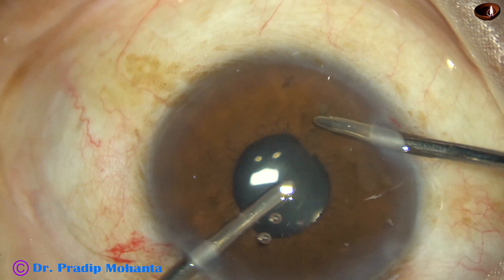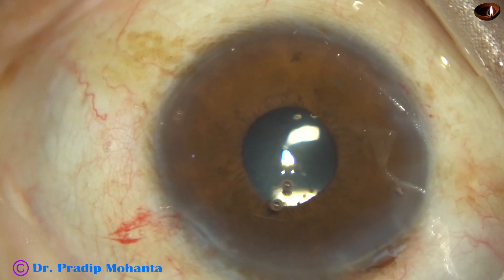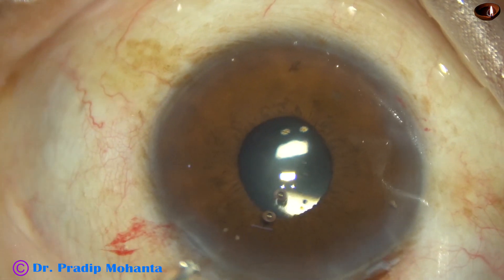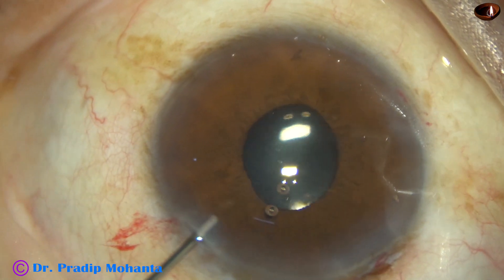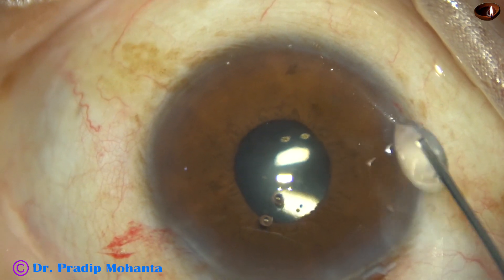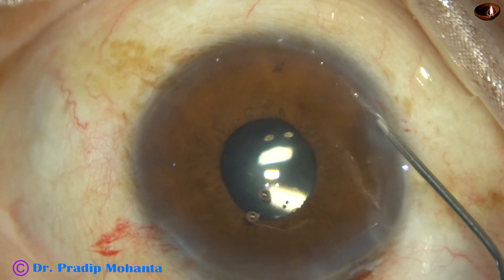Friends, we must remove viscoelastic. We must give some quality time to remove viscoelastic substance so that in the postoperative period we can avoid visco-induced raised intraocular pressure.